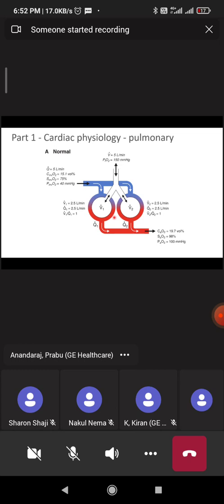That's why, definitely, the problem happened. An adult HME filter will add to the dead space. Yes, definitely it will add.